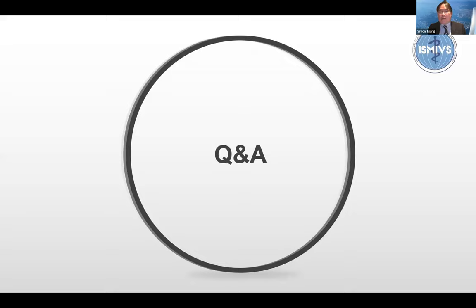Yes, it's incredible that you were able to perform HIFU in so many different indications. But I cannot agree with you more regarding how we consider HIFU as an ablation, because HIFU is actually the ablation modality which can be used even in very advanced cirrhosis. And that is when everything else fails. I think that's where we should place it, because it is not for early disease. It is actually the last resort in some of our patients.